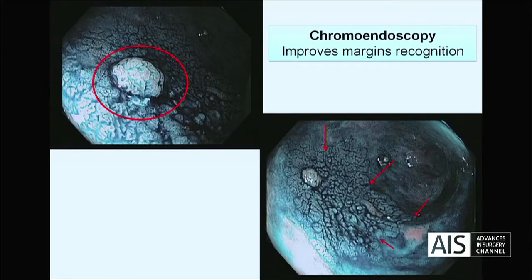Chromoendoscopy is also very useful to improve margin recognition. Sometimes we have a sessile polyp, but what we need to see is that along this sessile polyp there is a much bigger polyp — this was a rectal serrated lesion. If we had only removed the sessile lesion endoscopically, we would not have cured the patient.